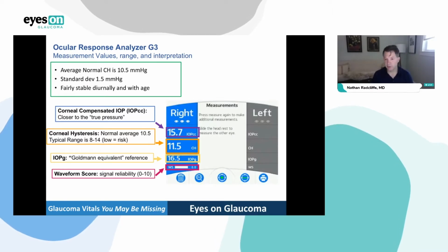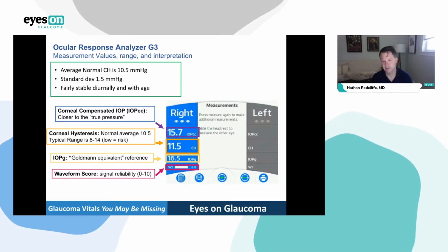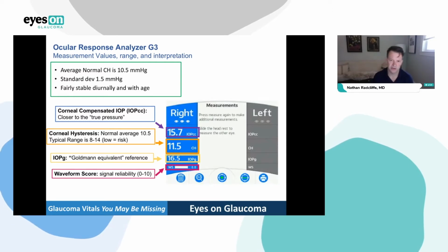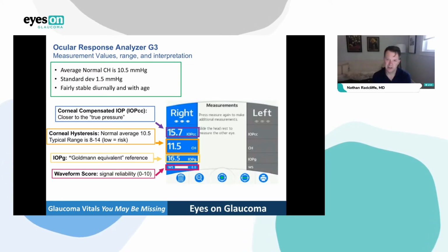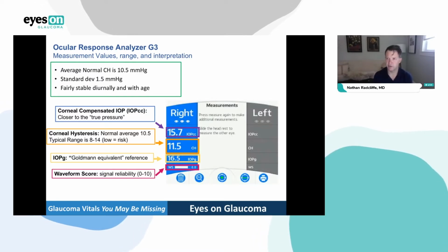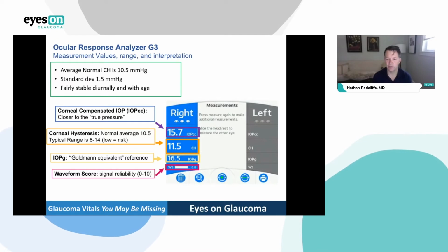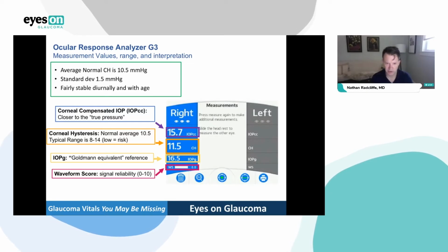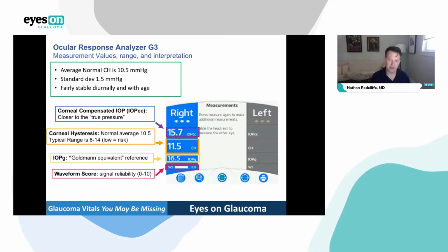So it also measures corneal hysteresis, which we'll be talking about, and it actually even takes that hysteresis value and adjusts the Goldman pressure for something called corneal compensated intraocular pressure. Just as you may have said, let me adjust this patient's Goldman tonometry for their thick cornea and take off 4 millimeters, corneal compensated intraocular pressure is a similar thing, taking away that hysteresis impact and giving you what the machine thinks is probably the pressure inside the eye after subtracting the shenanigans induced by corneal hysteresis. And shenanigans is the technical term.